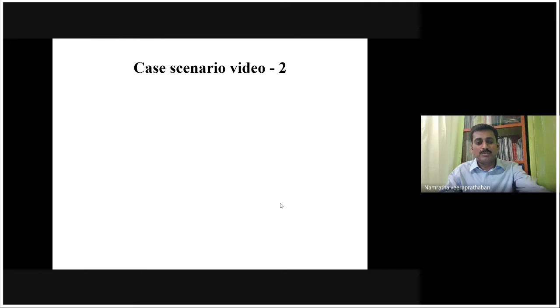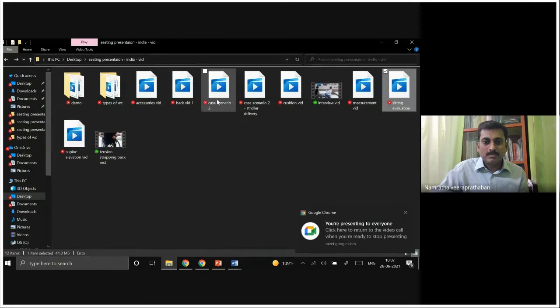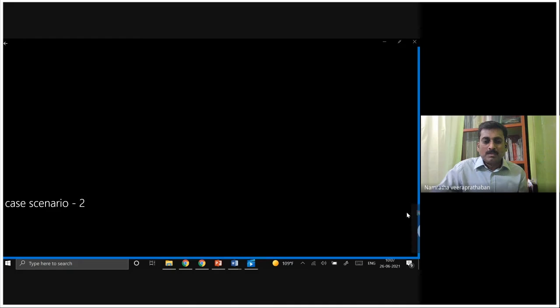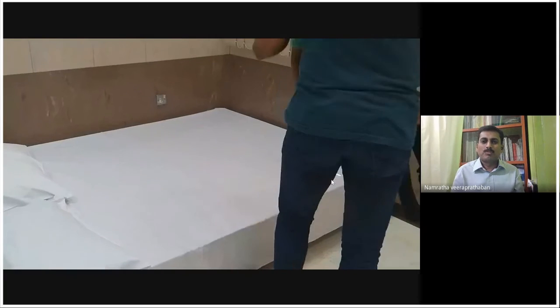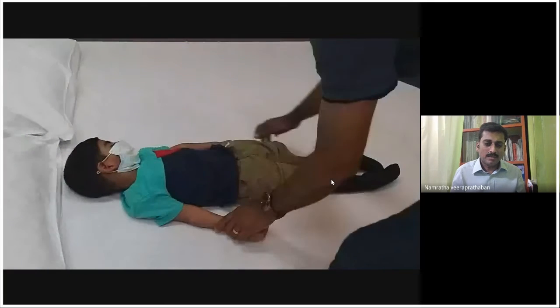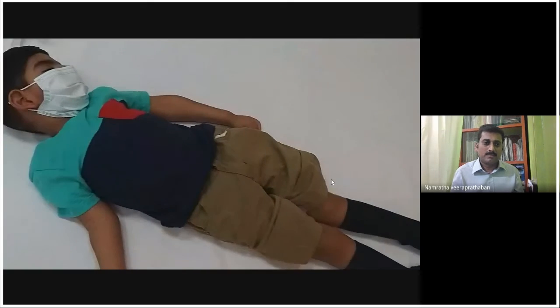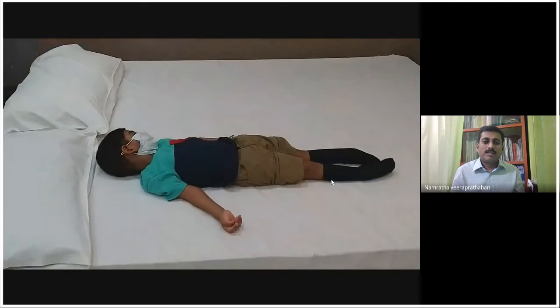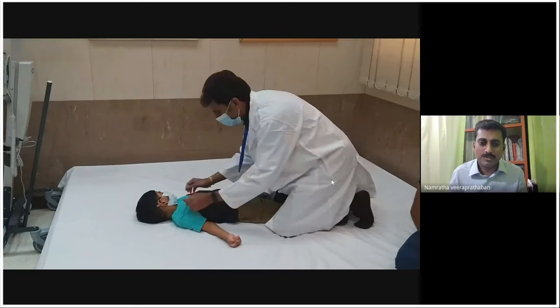Now I have another case scenario, one pediatric patient. Let's see that. You see, this is an Indian patient actually. He is almost a 4-year-old boy carried by his father to my seating clinic, and he is taking multiple anti-convulsion medications, so most of the time he feels drowsy. I have finished the interview and observed, and without further delay, I'll go to supine evaluation.